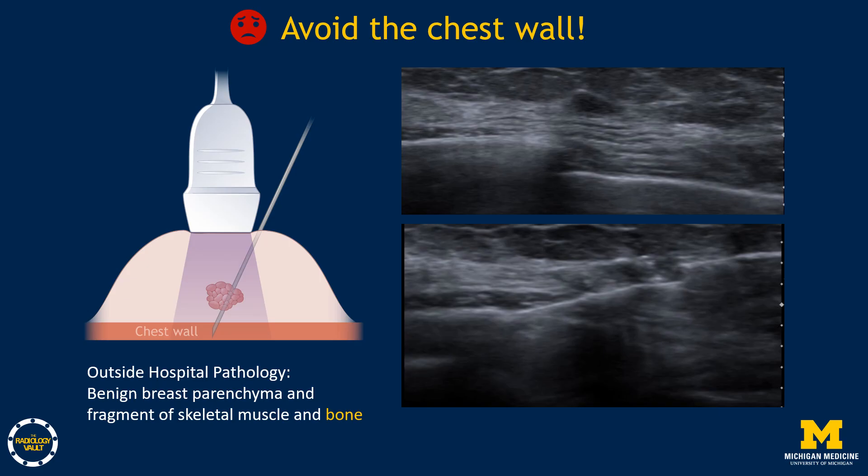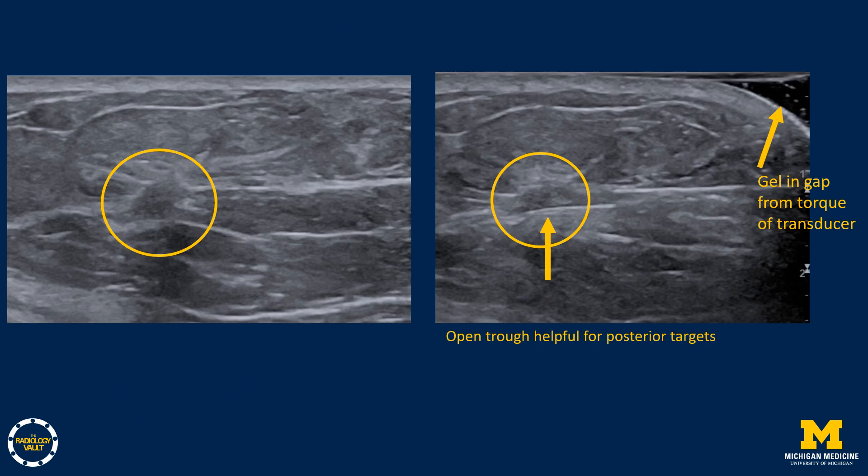Why is it so important to see your needle and stay parallel to the chest wall? A case from an outside institution shows the trough of the needle actually entering the chest wall, and internal review of the outside pathology confirmed bone in the sample. You want to avoid this. Most needles now allow an open trough technique: the needle is fired outside the breast to expose the trough, then inserted under ultrasound guidance to visualize the tip, avoid the chest wall, and scoop under the target.